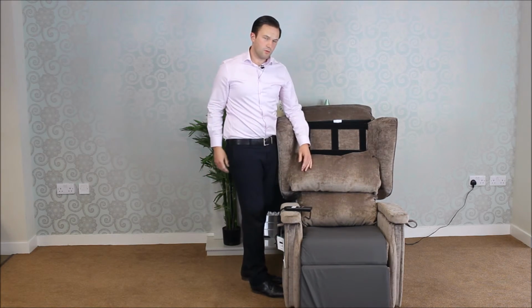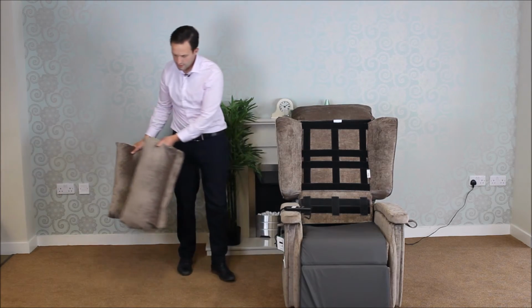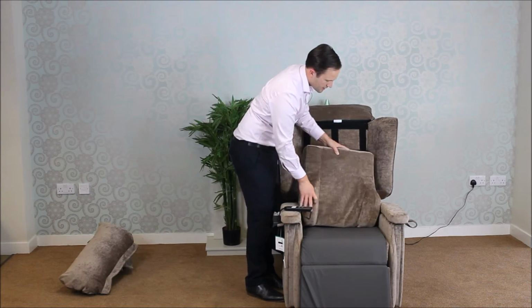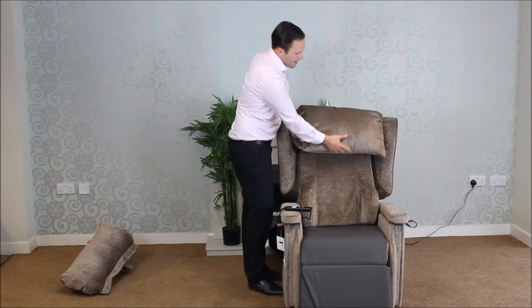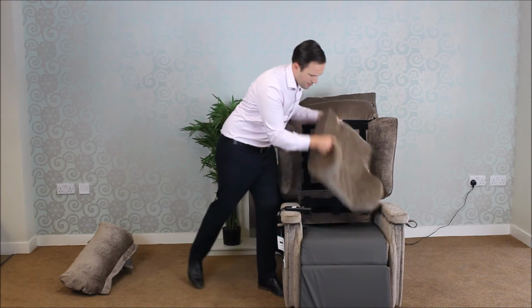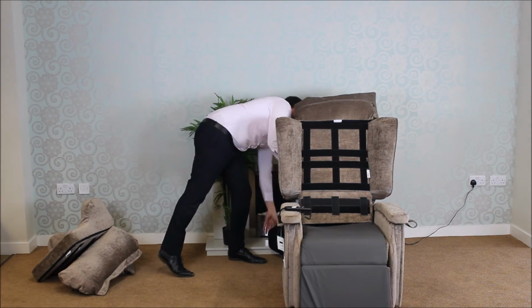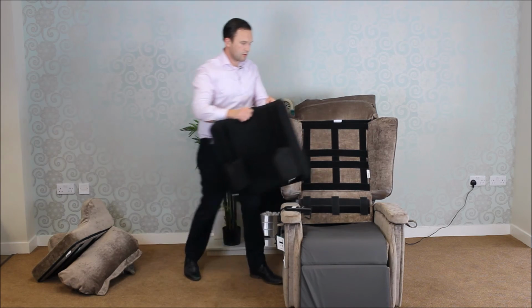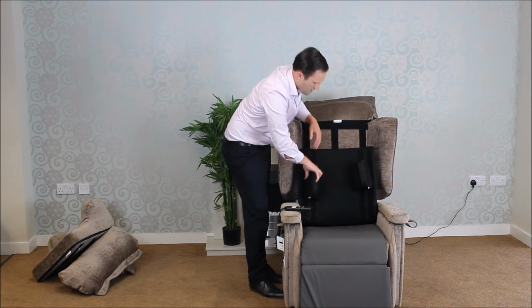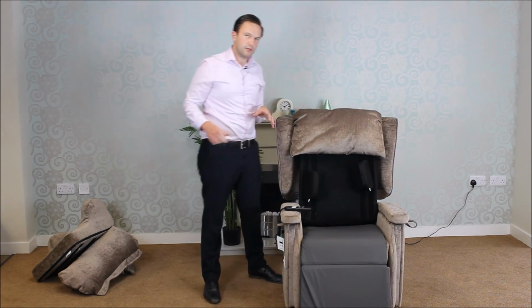If the user doesn't tolerate the waterfall backrest, you can try the lateral support backrest. This helps the user to retain a good midline posture and is really appropriate for users whose posture is flexible. Typically for users with perhaps MS or MND, those types of conditions where they need to be encouraged to retain a good midline. If this isn't enough, we can try the adjustable lateral support system, which provides a more aggressive level of lateral support. Here you can move these laterals any way you like to help to manage and correct posture.